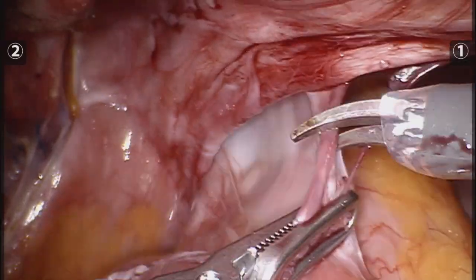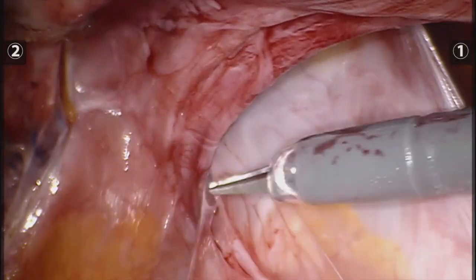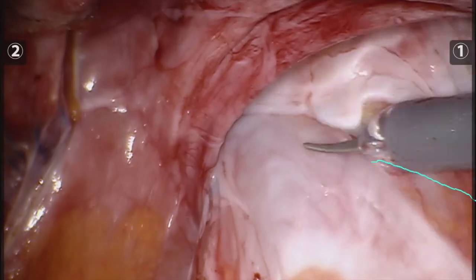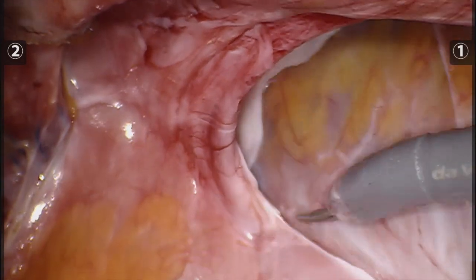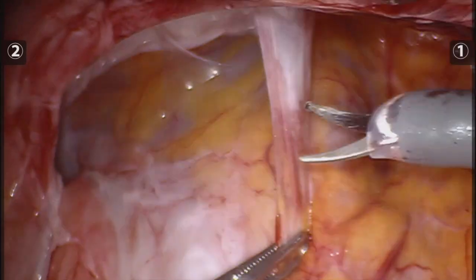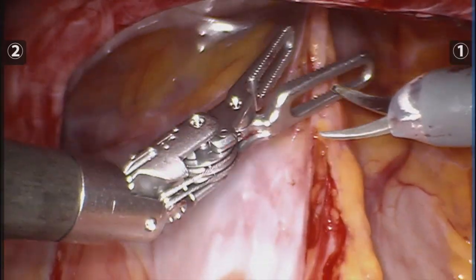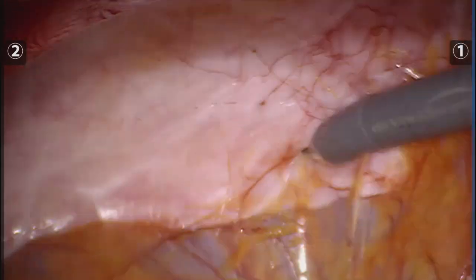Here we are exposing how we are able to dissect the sac away from the bowel, making the sac go inside of the defect and reducing the bowel inside of the abdominal cavity so we can later expose the defects and the anatomy that will be key to finding the retrorectus space.